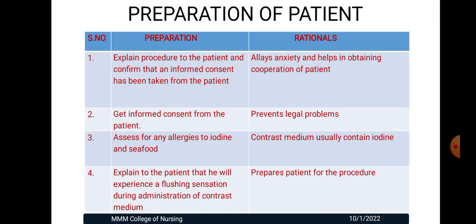Coming to preparation of patients. Preparation and rationales. Explain the procedure to the patient and confirm that informed consent has been taken from the patient. It allays the anxiety and helps in obtaining the cooperation of the patient. Get informed consent from the patient. It prevents legal problems.